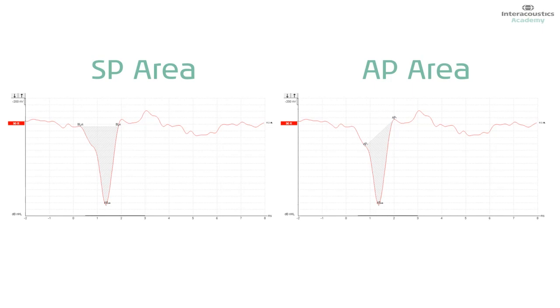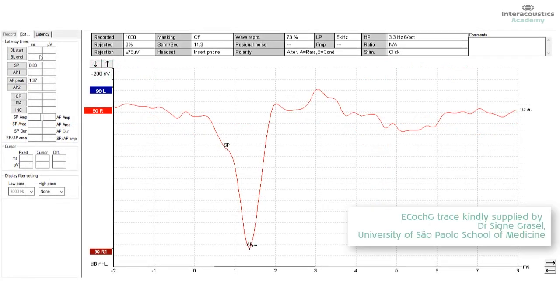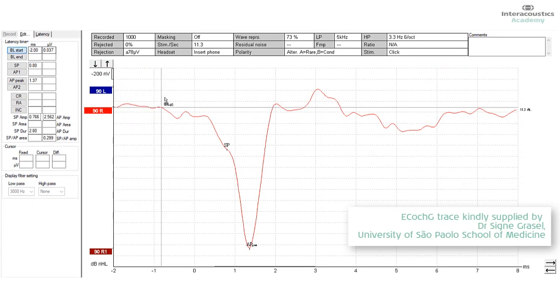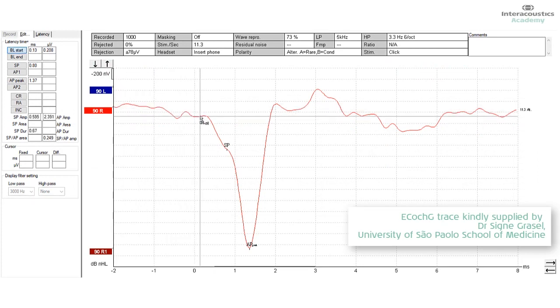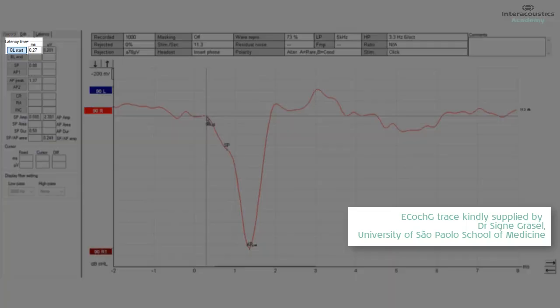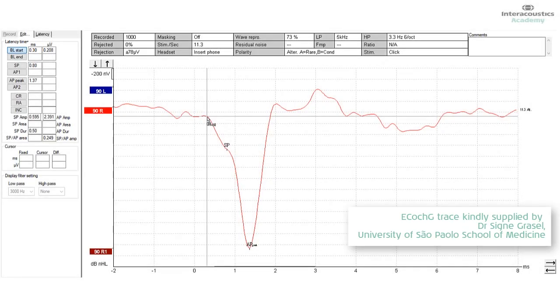And the way we measure that, very importantly, is we identify the point where the SP begins. And again, in most ears, even with respect to hearing loss, the SP is going to begin at about 0.3 to 0.5 milliseconds post-stimulus onset. So we identify that point as our starting point, our baseline start.